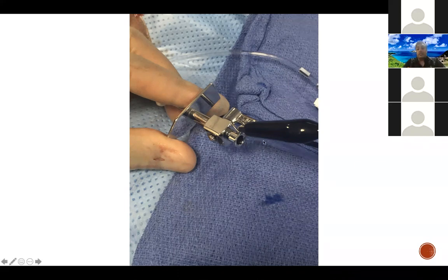So initially, we were able to visualize the BRK1 by basically hooking up an alligator clip to the stylet in the BRK1 and then jumping that to one of the CS poles. Again, I wasn't as comfortable with this technique. I don't use it anymore because it does mean that your stylet has to be out while you're dragging it down. That means the stylet is actually what you're sensing off of. I had never had any complications from it, but the stylet, as you know, is pretty sharp. So dragging that down can make people a little nervous, but it is possible. And I did this for a couple of years without any trouble whatsoever.